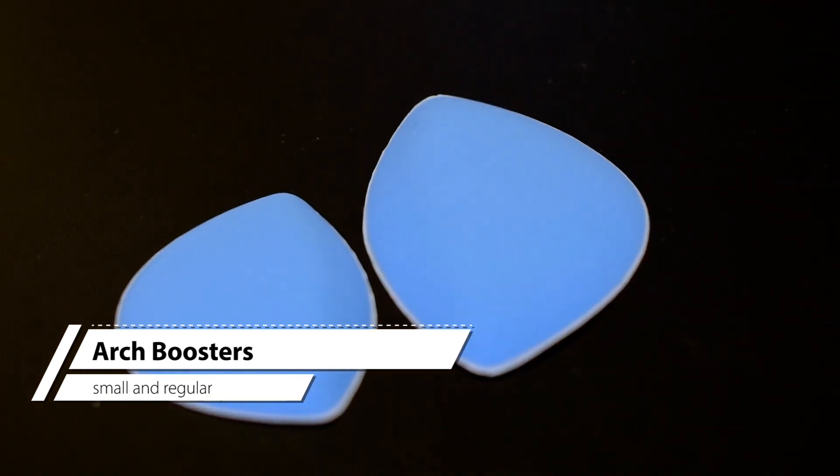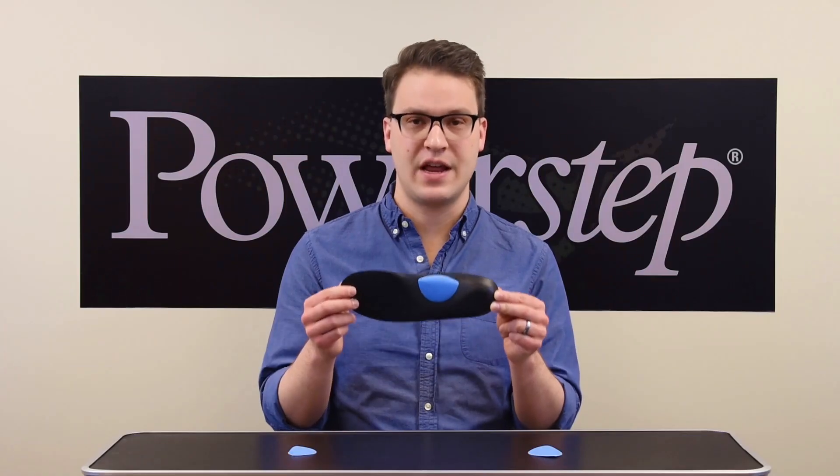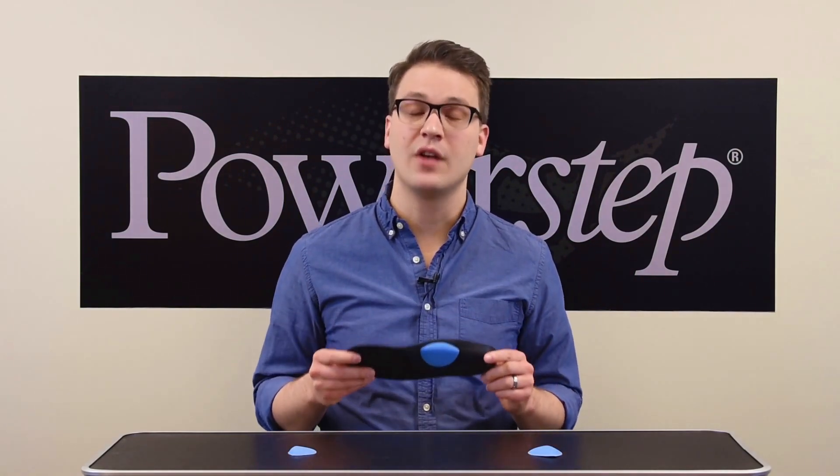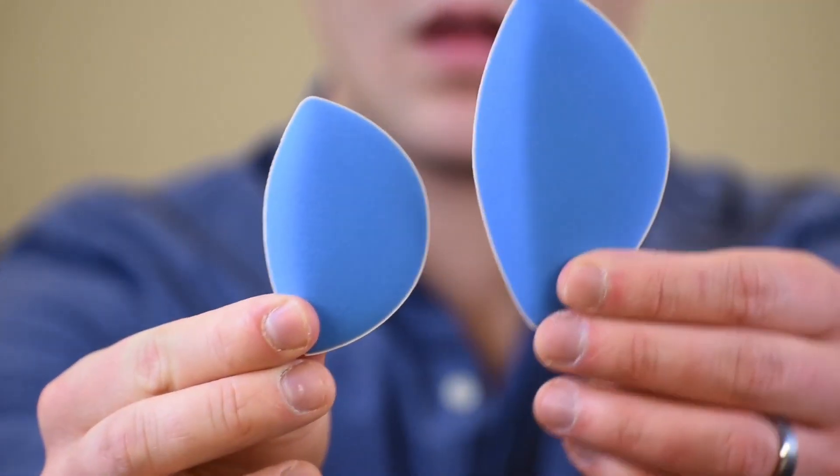Arch boosters help provide extra support under the arch and mid-foot. This will help fill out the open space under the arch to prevent excess movement. These also come in small and regular sizes.